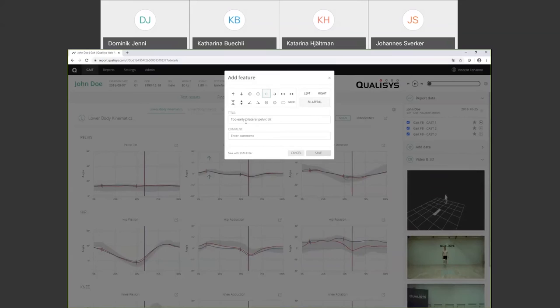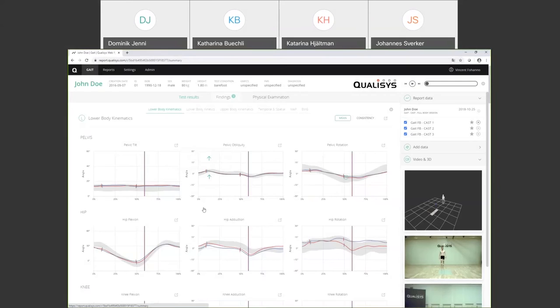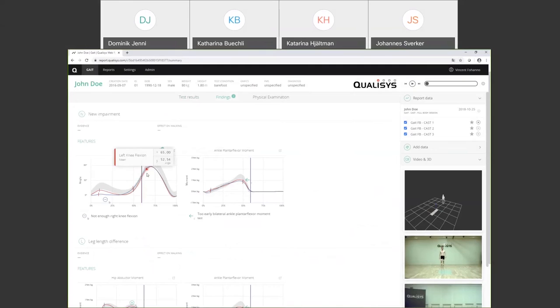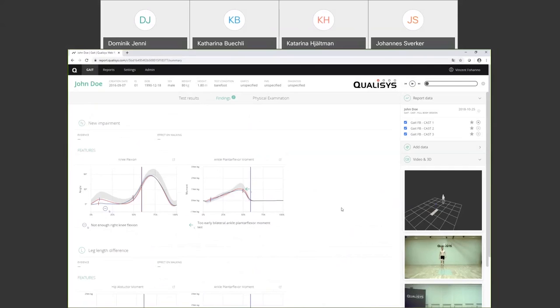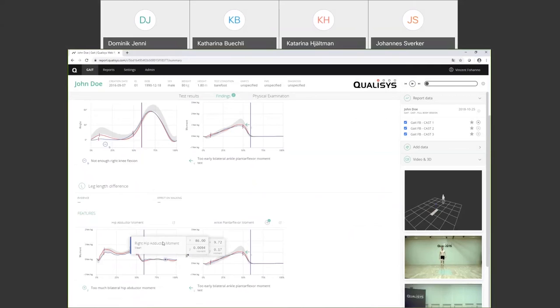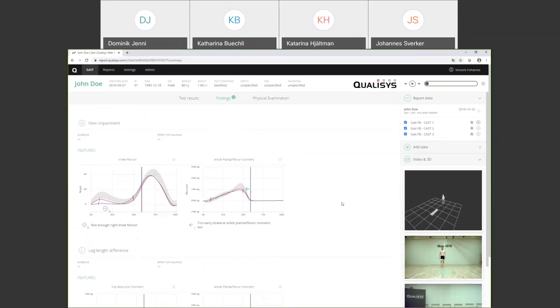An important feature of the web report is interactivity. You can add findings — for example, 'bilateral pelvic tilt too early' — as comments. These findings are then collected so you can easily identify what was important in the measurement. You can also connect related findings — for example, linking leg length difference to pelvic tilt, indicating one problem causing multiple effects. The skeleton is also animated in 3D alongside the recorded video.